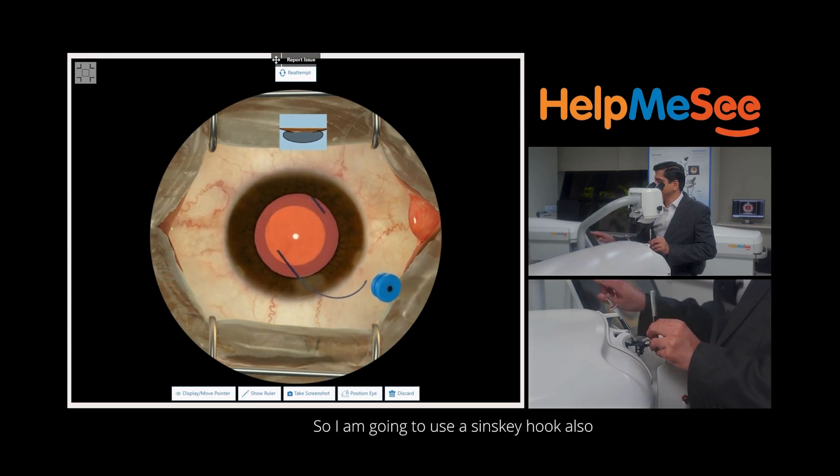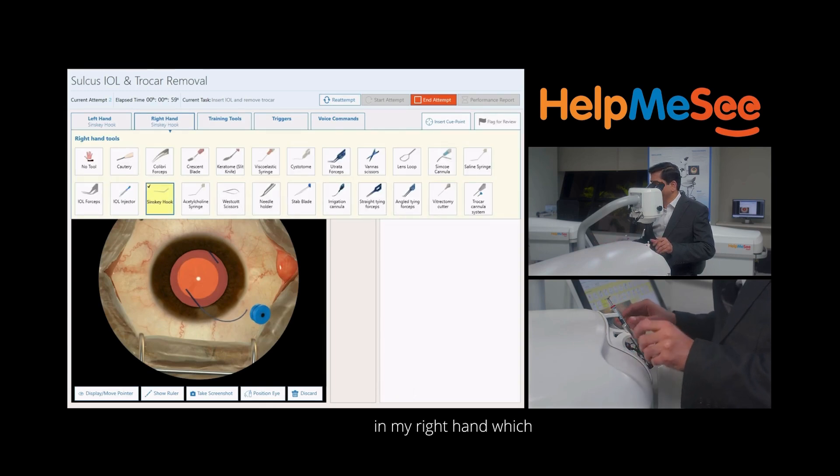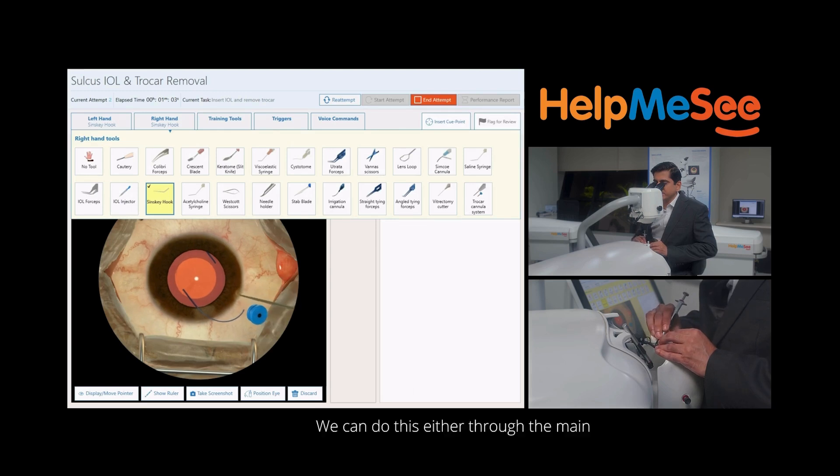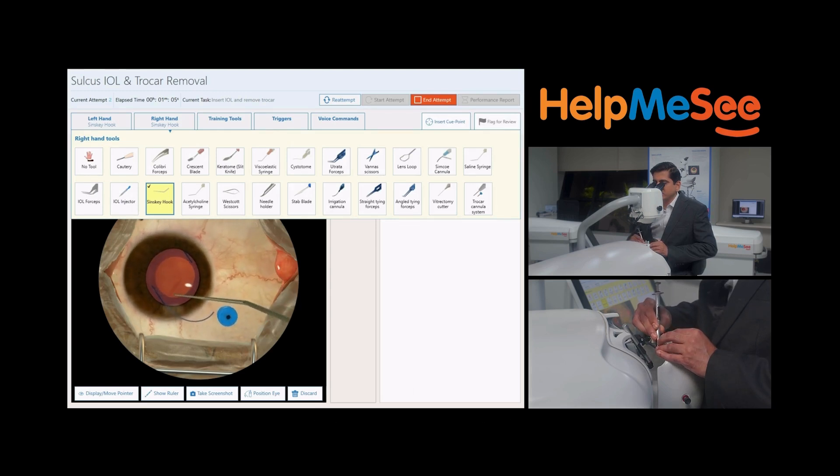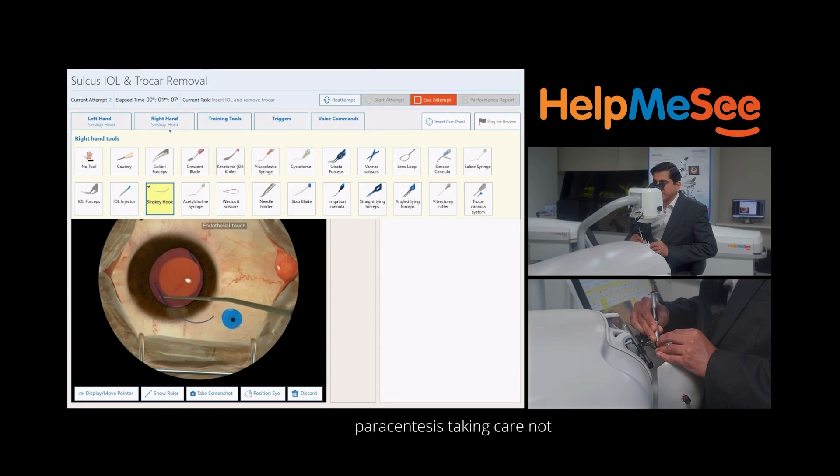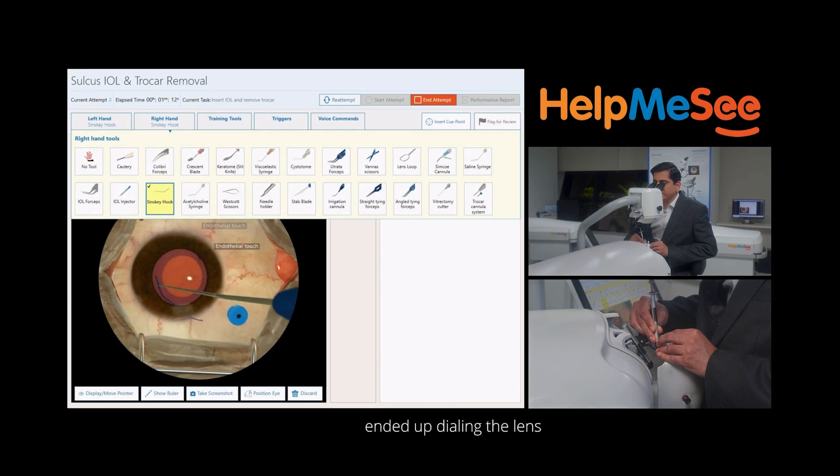I am going to use a Sinskey hook also in my right hand which will help me to dial this lens correctly in place. We can do this either through the main incision or through the parasynthesis taking care not to damage or touch any of the structures. In this case we ended up dialing the lens correctly inside the sulcus.